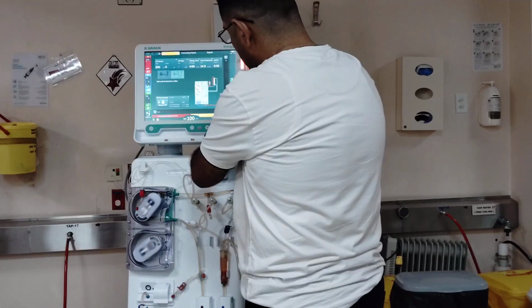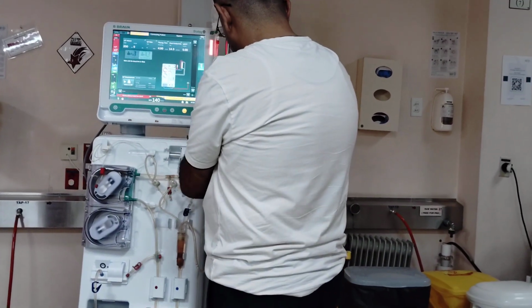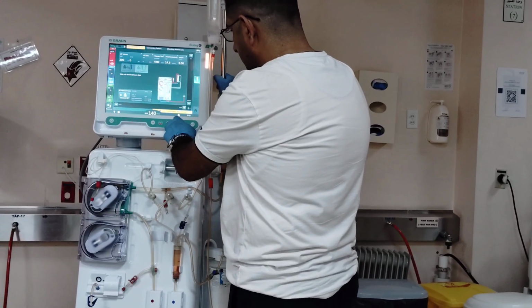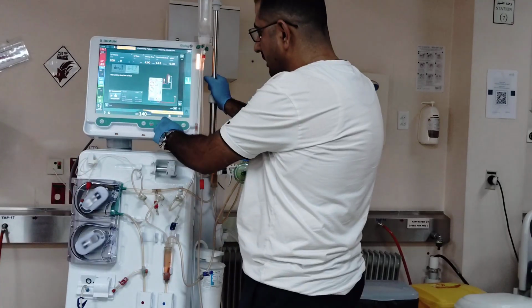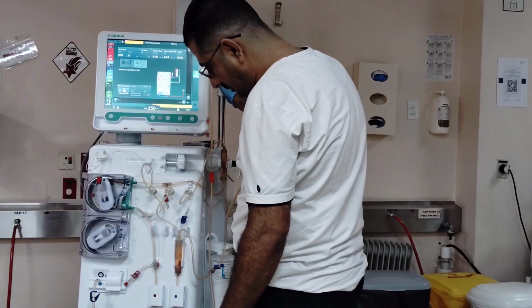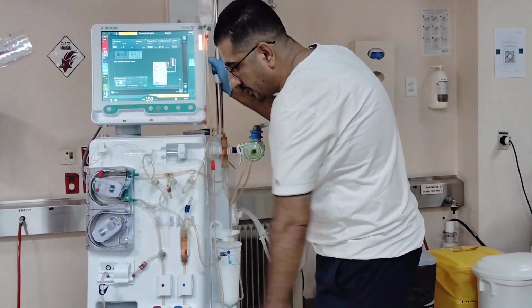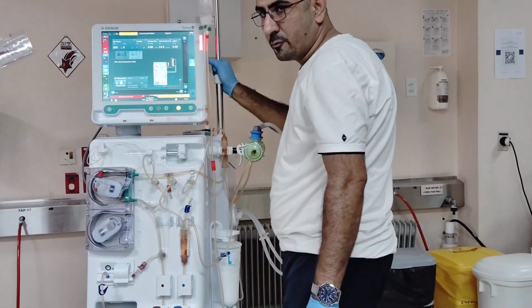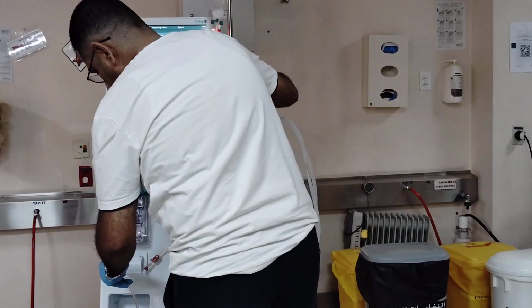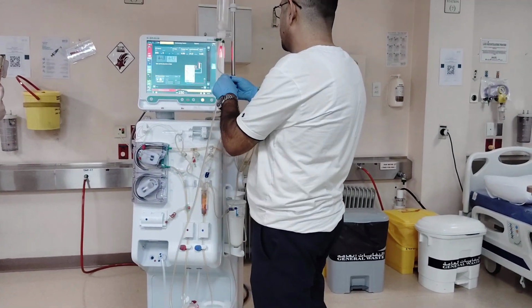Venous pressure. Blood detected. Or clumps. Now suppose the blood reaches here, you will get an alarm to connect your patient. So you press here, and this is the time to disconnect and connect your patient.